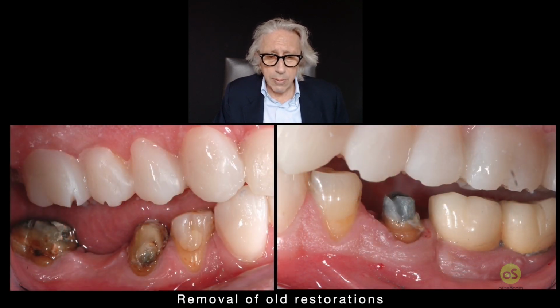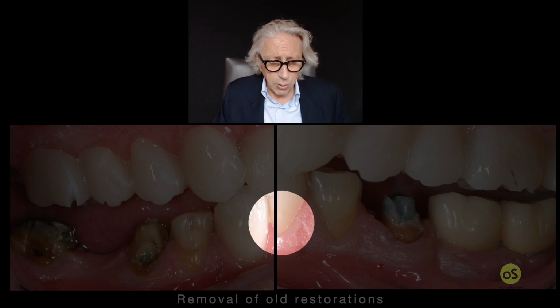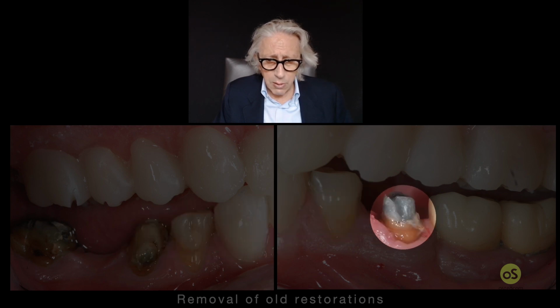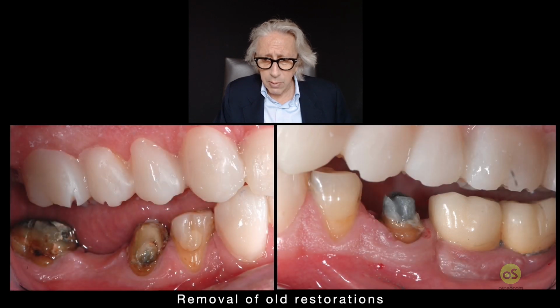So we have removed the restoration on the back side. In this case, we have to recreate a new bridge, preparing the teeth, preparing the new bridge. In this case, a crown over here, and then you have the 3 implants that we have just prepared slightly. We will see later on.